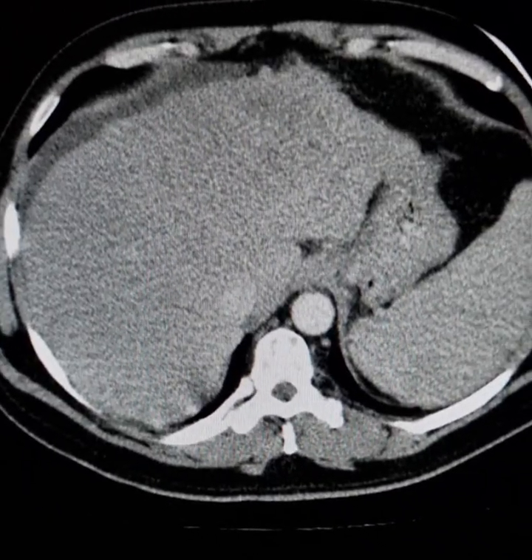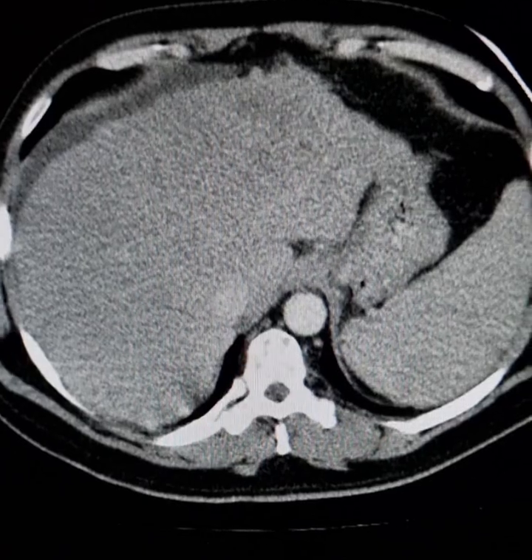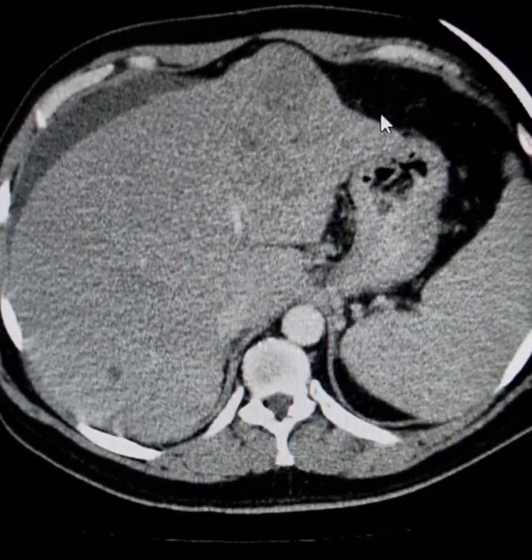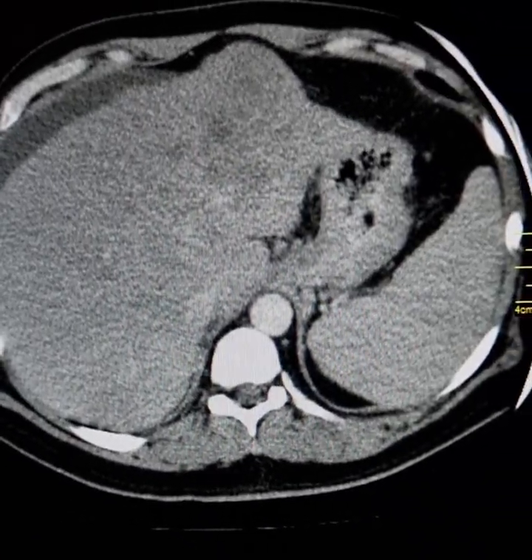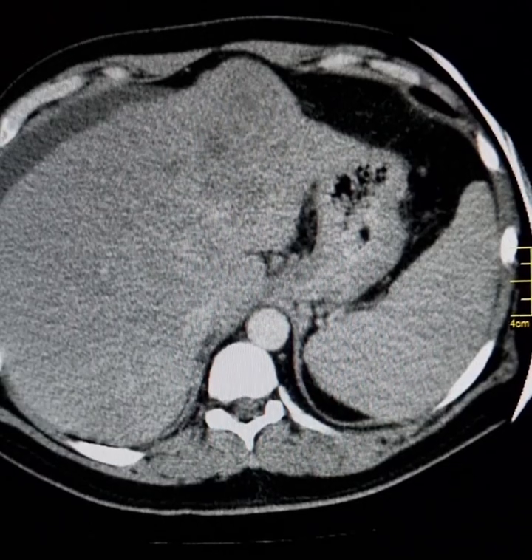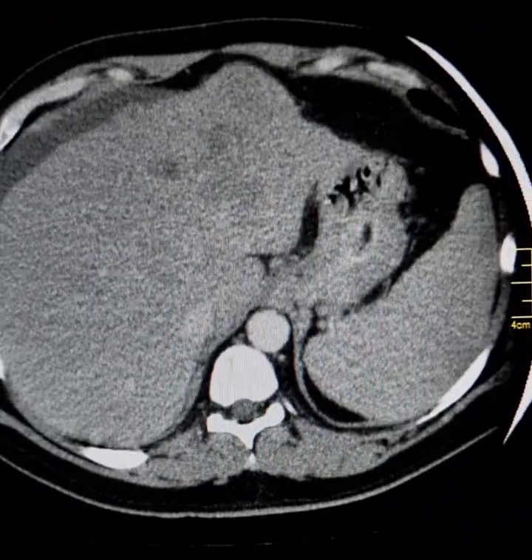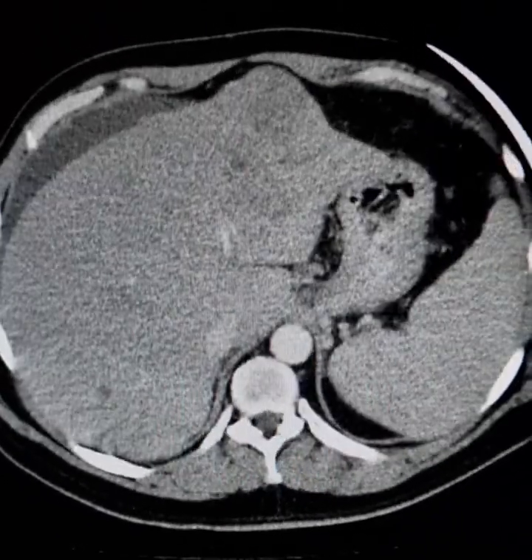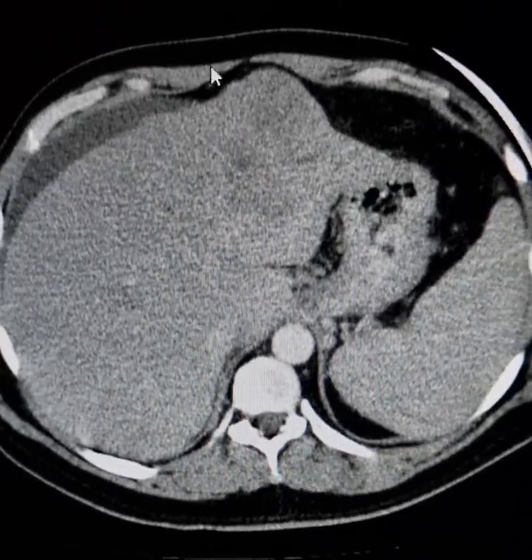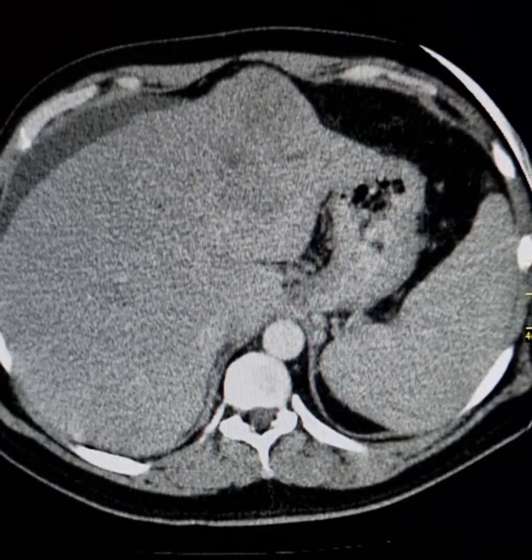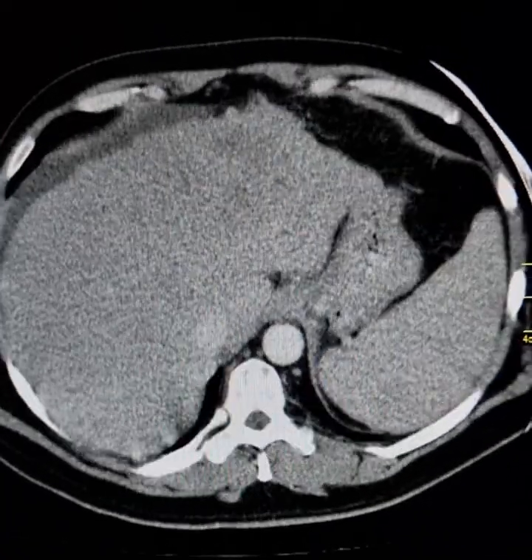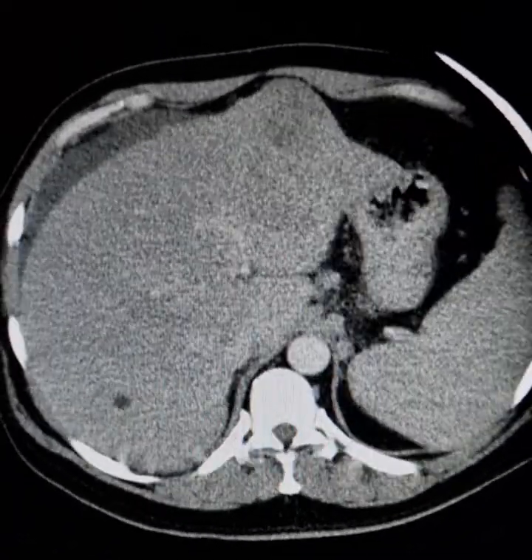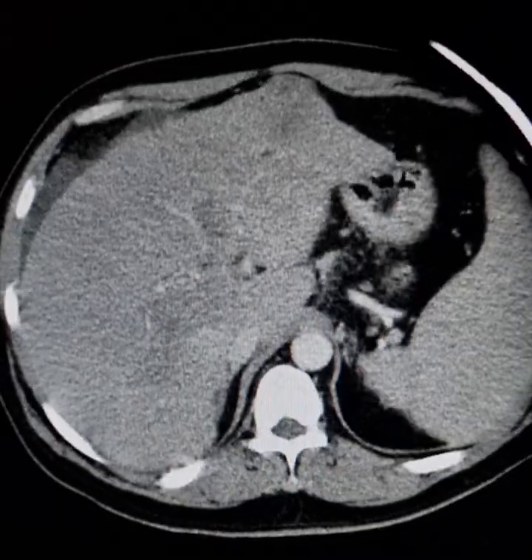Note the wavy hepatic outline. There is a large mass here which has involved the left lobe of the liver — segment 2, segment 3, 4a and 4b.